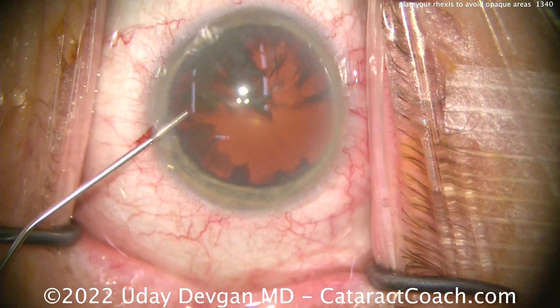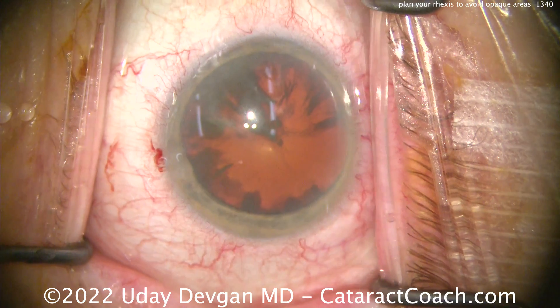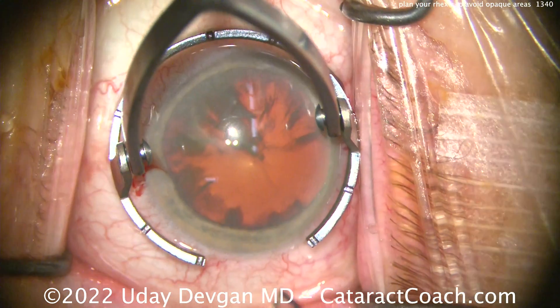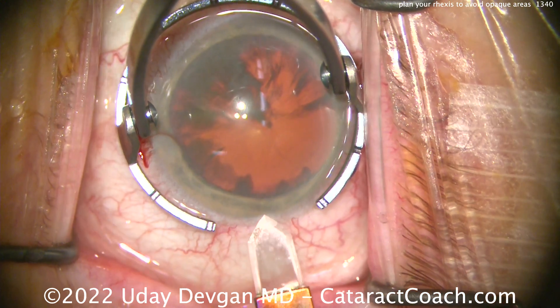My advice here is: you can just plan out your rhexis so that you only let go of the capsule to regrab it in an area where you have good visualization.